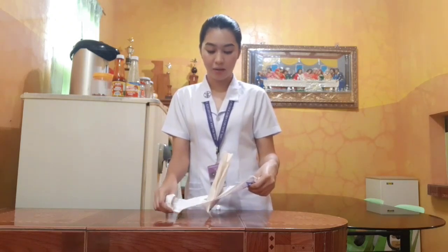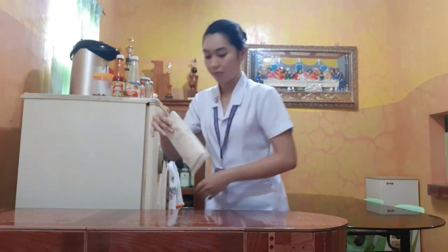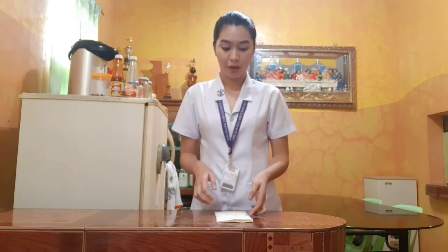Okay, now grasp the inner package and place it on a clean, dry, flat surface, because any moisture on the surface could contaminate the gloves. And we must keep in mind that the surface must be at waist level, because any object held below the waist is considered contaminated. Okay, now we're going to open the inner wrapper.